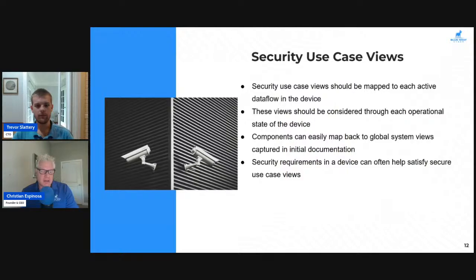So one of the things I hear you talk about quite a bit, and I know it's been an attack we've been able to pull off, is a DICOM image. So that would be the data flow. If I have a system that ingests DICOM images, it has some AI component that does some analysis and image enhancement, and then sends a DICOM image back out to somebody else to look at, that's the data flow. And what controls will we need to have on that data flow to prevent things like a bogus DICOM image from being ingested in that system and bogus output?